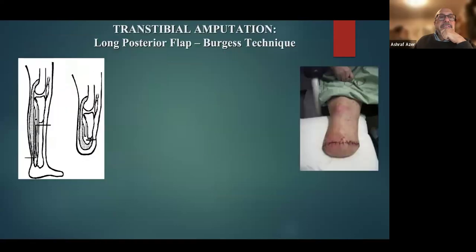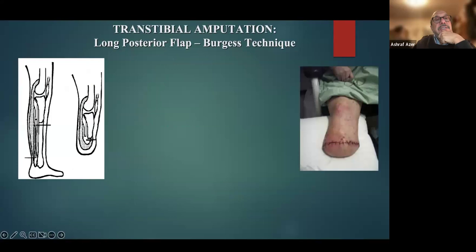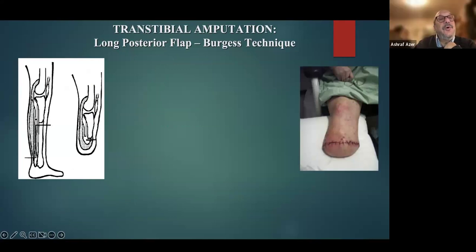Look, it is easier to do it this way. Can you see the cursor here? Yes. So here you measure the cut end of the bone. We're talking about 15 centimeters from the tibial plateau. Now we measure the circumference of this area. If you find the circumference around this area is, say, 30, add 5 centimeters to it for the whole length.